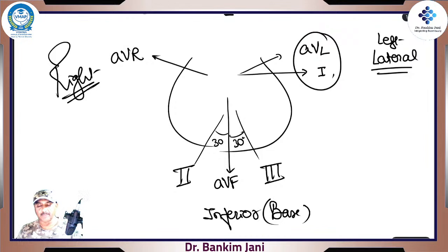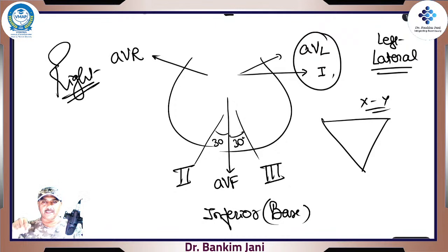You just remember this. Tomorrow we'll be superimposing lead 1, V1, V2, V3, V4, V5, V6, and it becomes crystal clear. Right now we are working in 2D because of the planes, which are like flat planes, like dealing with the x-axis and y-axis. To that we'll be adding the z-axis, which comes out from my heart and goes towards you. Once you know this, we'll start with all the abnormalities and what to see. Things will be absolutely easy.